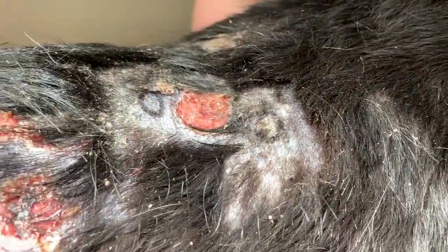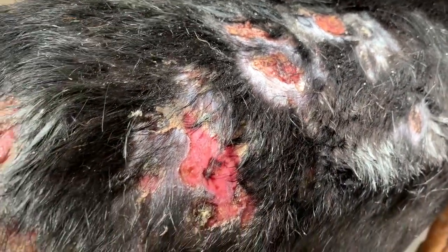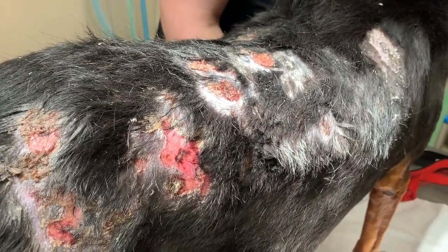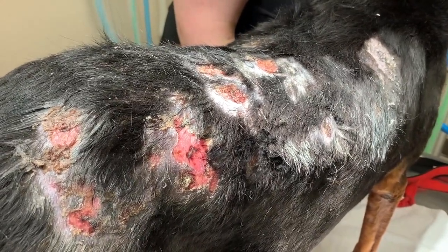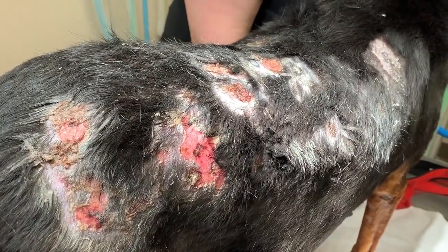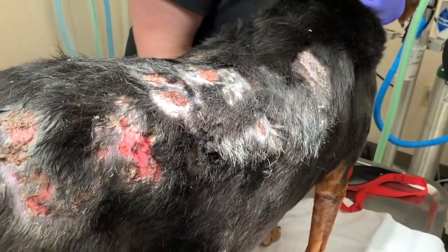Rudy's a pretty calm dog, so we're going to be able to do this with just lidocaine. We'll put about one milliliter of lidocaine in each location. For a smaller dog, you need to make sure you don't exceed the amount of lidocaine that you can safely give to them.